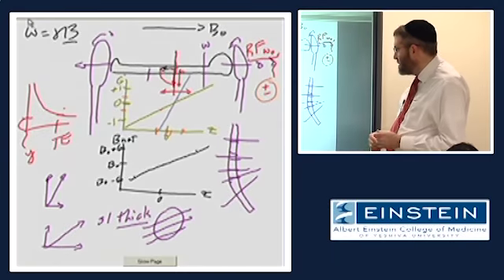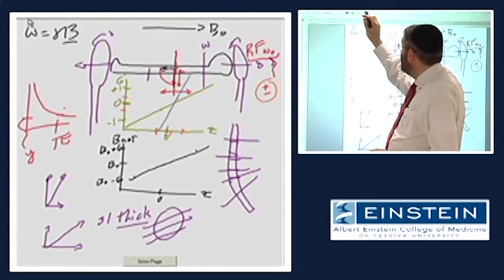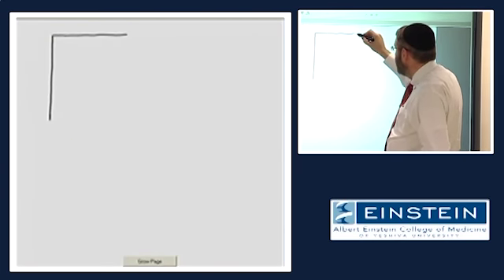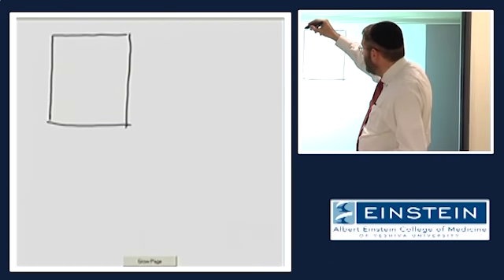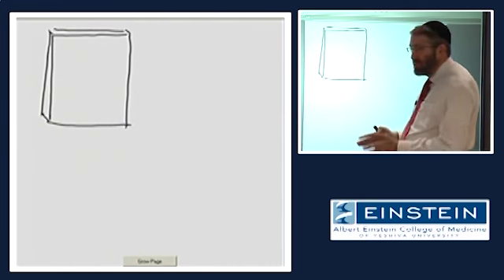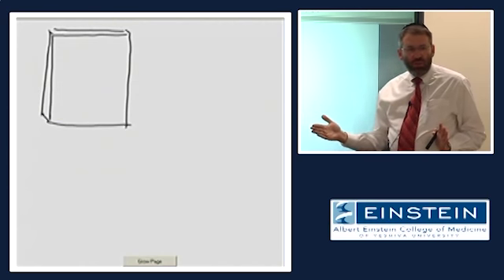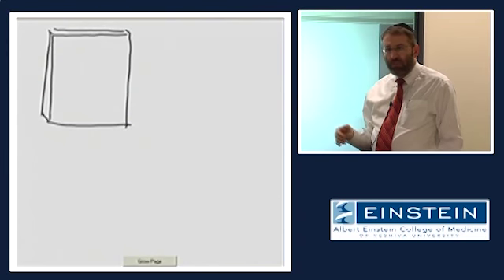Okay, so this is the easy part. And at this point, we have our image, which is a representation of some slab of tissue, right? The thickness, of course, is a function of the combination of the range of frequencies that we transmit and the slope of the gradient magnetic field.